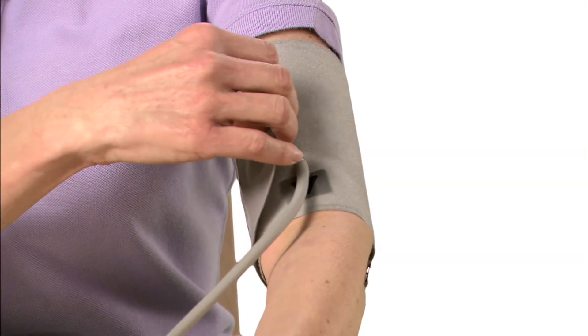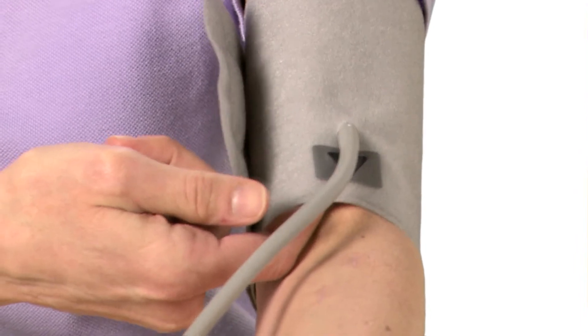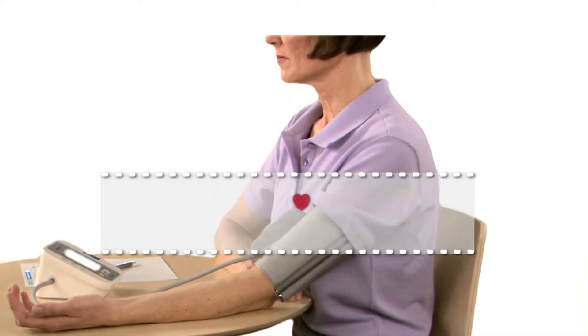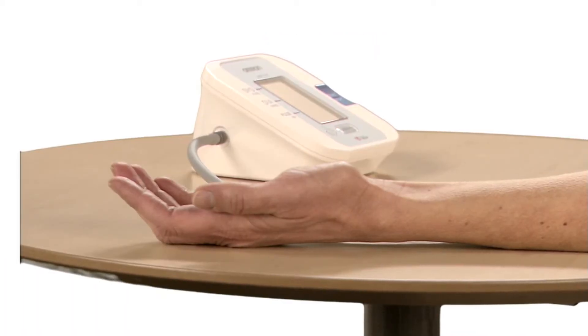Close the cuff snugly. Place your finger between your arm and the bottom of the cuff to allow for space. Place your elbow on a table so the cuff is level with your heart and your left palm up.